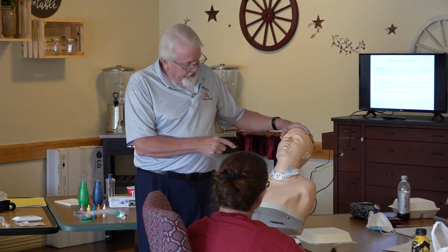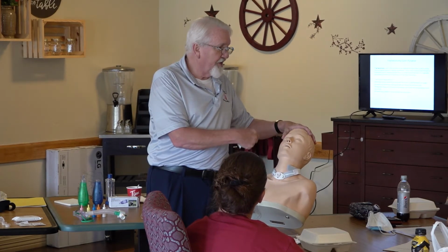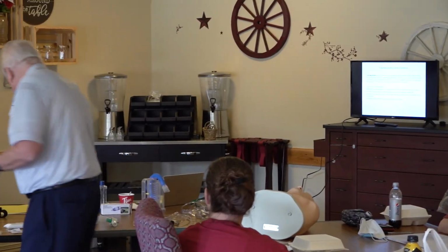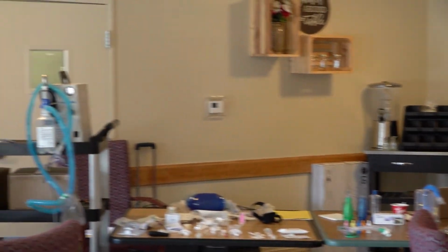So we've got everything cleaned up real good, and so we're going to say an hour or so ago they bathed Bob, so his collar is soaking wet. So I need to change the collar. Dang.